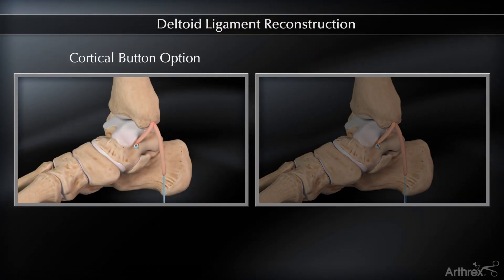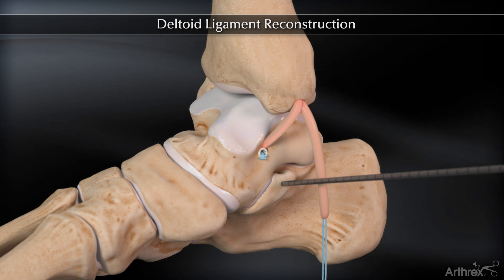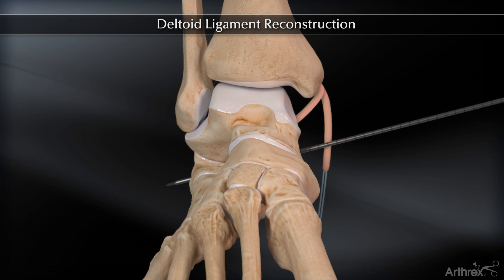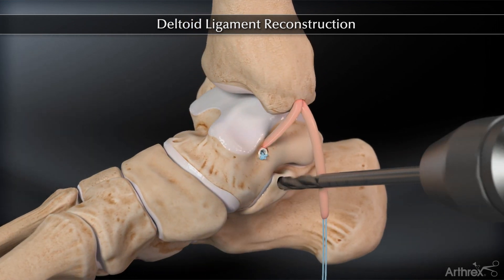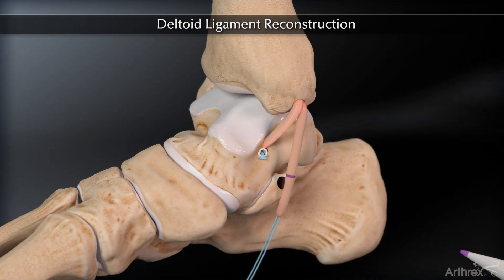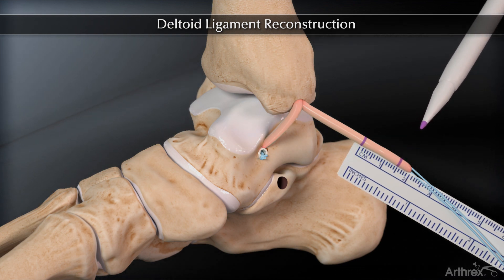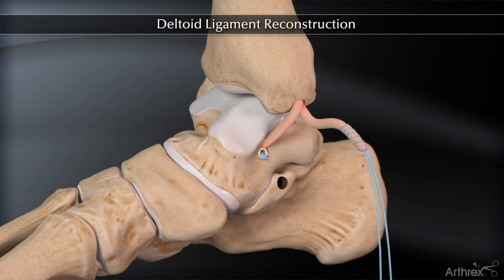For cortical button fixation in the calcaneus, use the spade tip drill pin to create a bicortical tunnel in the calcaneus starting 1 cm anterior to the posterior edge of the sustentaculum. Aim slightly plantar and posterior to avoid the subtalar joint and peroneal tendons. Overdrill the guide wire to a depth of 15 mm. Tension the free limb of the graft and make a pen mark at the insertion point of the graft into the calcaneal tunnel. Trim the graft 15 mm distal to this mark and whip stitch the distal 15 mm of the graft using a number 2 fiber loop suture.